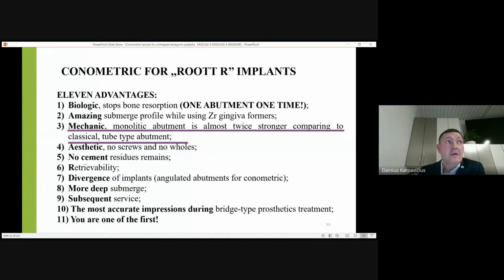And here, talking about our system, we understood that we have to be much more resistant with implants, because a fracture of the abutment might appear, but we can change it, or we can switch to monolithic abutments, which are much more powerful compared to the regular two-piece tube type T-base abutment. But if the implant fractures, it's a total disaster. We have to remove everything.